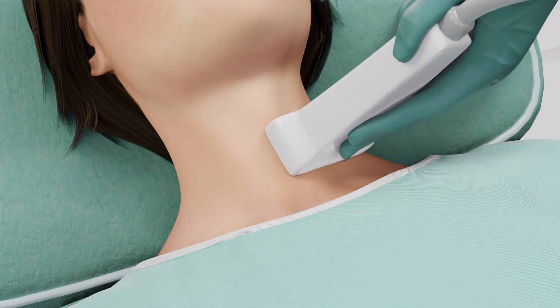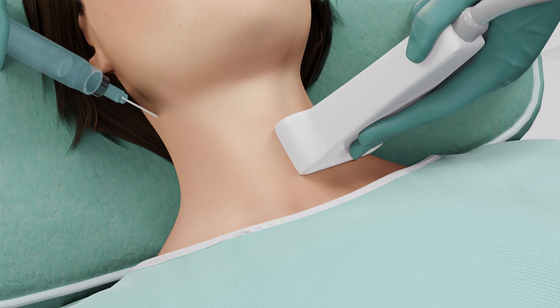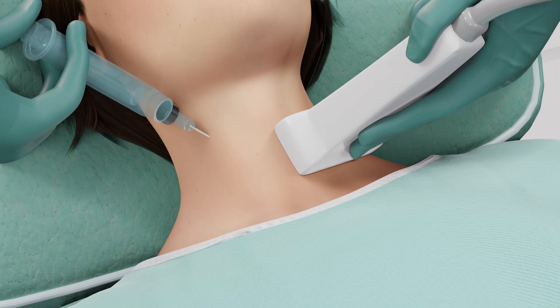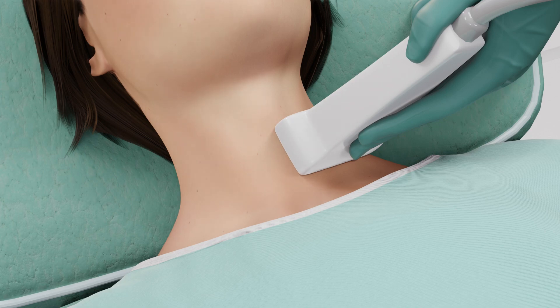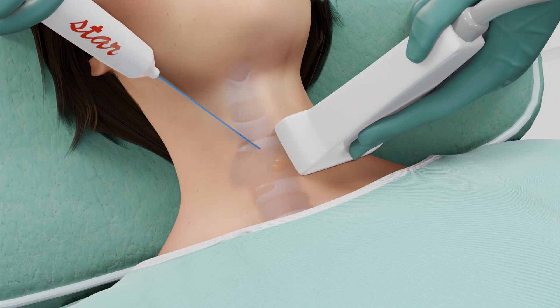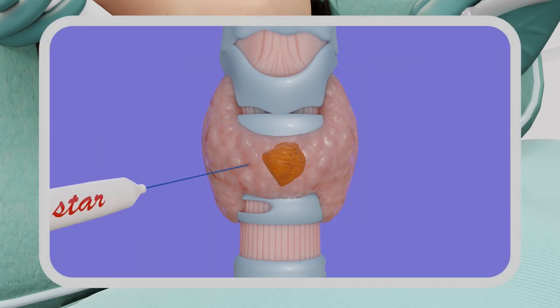Some numbing medication may be administered before local anesthesia is injected into the skin with a thin needle. You may feel a prick when the local anesthesia is injected. However, there is usually not a significant amount of pain with this procedure. Under ultrasound guidance, the StarMed RFA electrode is now inserted and positioned into the targeted nodule.